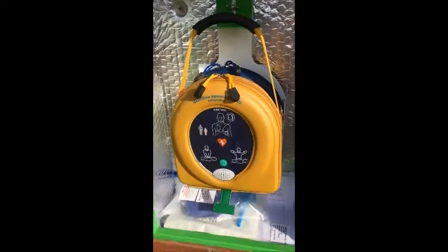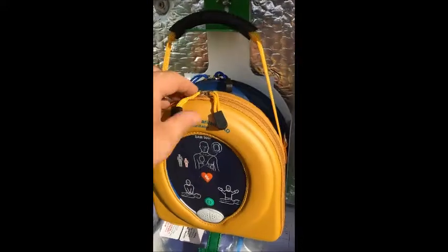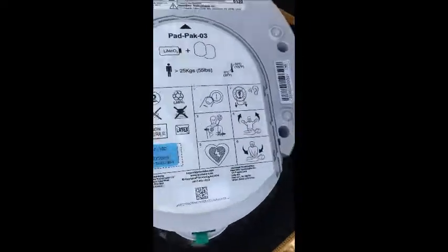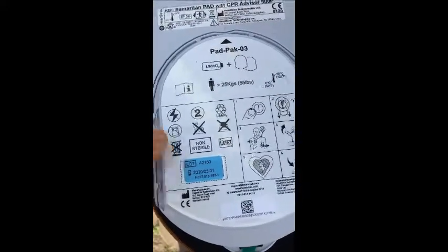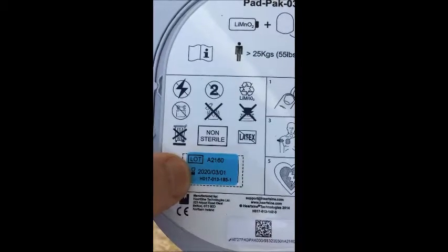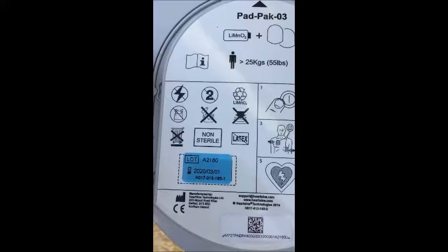The next two questions concern the dates on pads and battery within the defib. This will vary depending on what type of device you have in the cabinet. On this Heartsine Pad 500P, when you take the defibrillator out of the case, you can see a date label on the pad battery pack. As this device has a single pad and battery cartridge, there is only one date code — on this one it's the 1st of March 2020, so there's plenty of time left. For both questions — pads and batteries — we can answer yes.